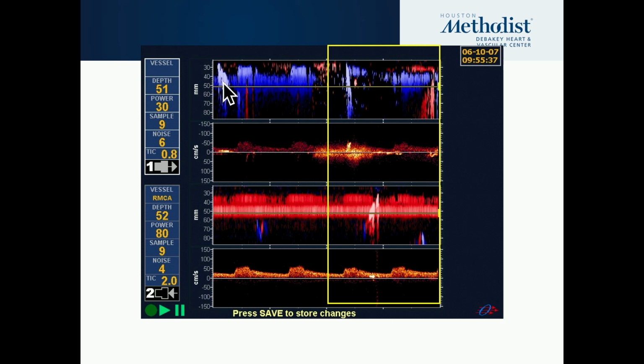So the other one went through the cervical internal carotid, but did go to the ACA. This is why it's blue. If it goes to the MCA, it's red. If it goes to the ACA, it's blue. And it didn't come out as fast. It's maybe looking at something here and there. It's not as obvious with that signal. Probably it's a little bit smaller as well.